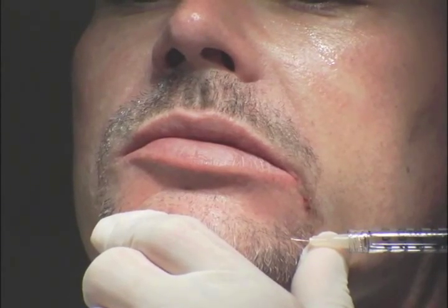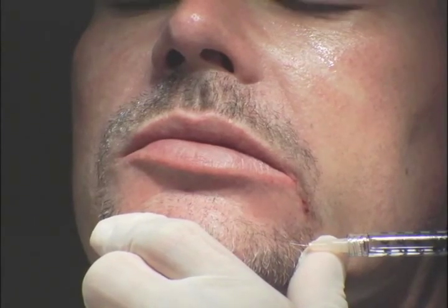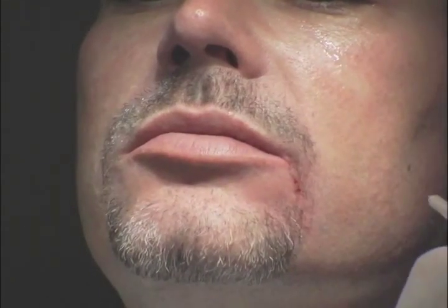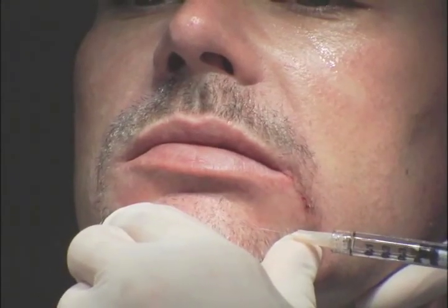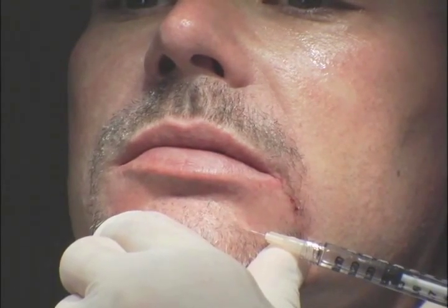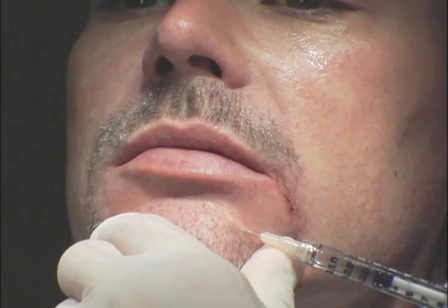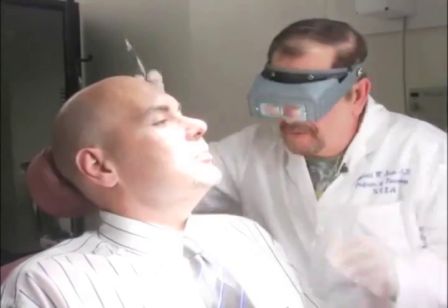And we flow it, and it's a little more difficult because, again, this is more viscous, so we're using a 30-gauge needle. That gets rid of the dent there. And then what we want to do is get rid of a little bit of the dent over here. So again, we stretch this very, very tightly so it doesn't hurt. And we use a serial puncture. We press in the needle and let the material flow under the skin. In doing so, we raise up the skin, this dent, this depression in the lower third of his face. Okay. Now, that did very, very well.